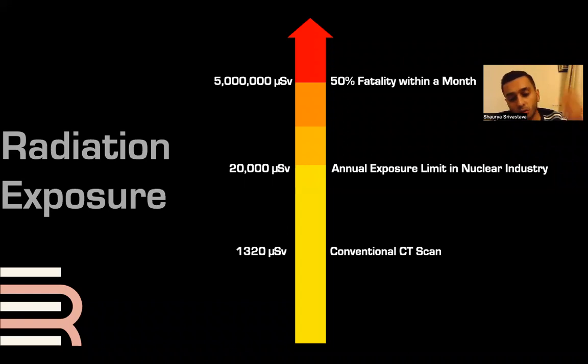Right. So going into what is a misconception, or a big topic of discussion: what about radiation exposure when we talk about CBCTs? You have patients who might ask you, for example, in India, we don't get asked many questions about a diagnostic tool when it comes to radiation, because they have a lot of blind trust. But in the UK, America or Europe, we get a lot of questions: oh, we have to go for a CT scan of some sort, what about radiation? Is it mandatory? But in all honesty, it really does not make that much of a difference.